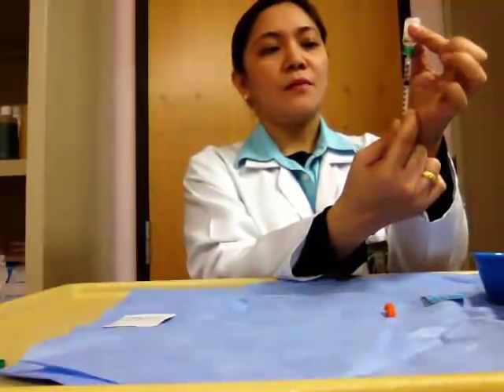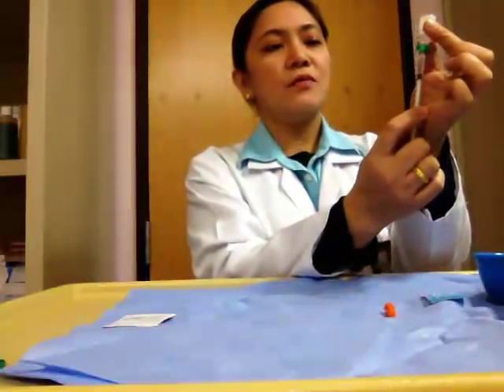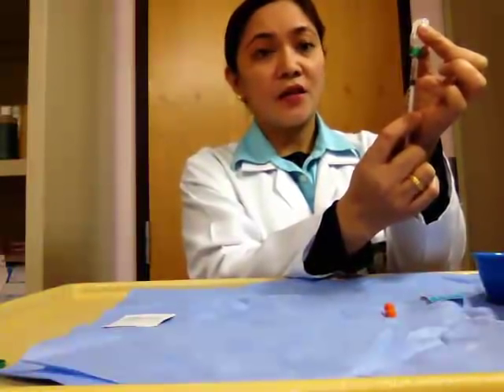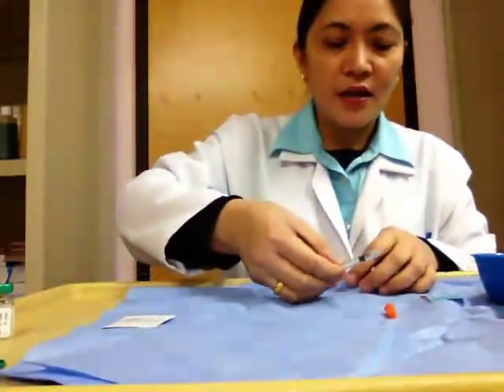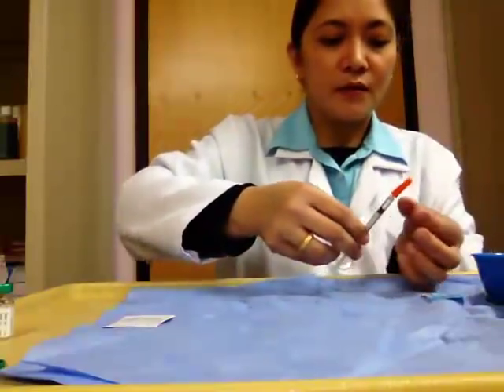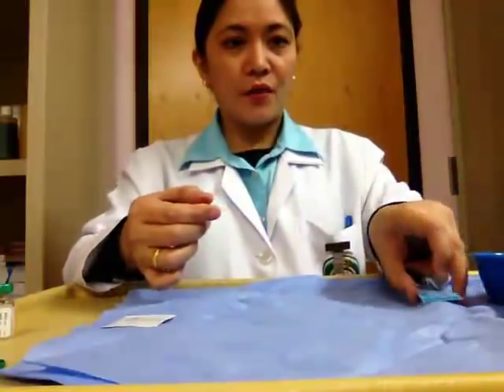This is somewhat a little bit viscous, so it takes a little time for us to aspirate the medication, plus the fact that the needle is very fine, gauge 29, so it takes a little time to get the medication. Okay, so it's now 20 units. We'll see it's at the 20 unit calibration, and then recap your needle using the scoop method. Okay, fix it well, and now we are ready to go to our patient's room.